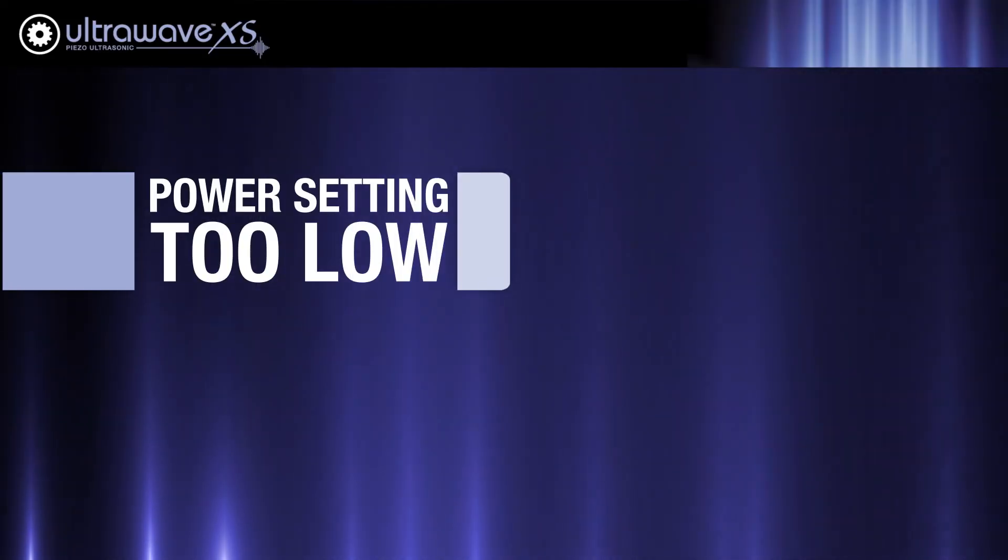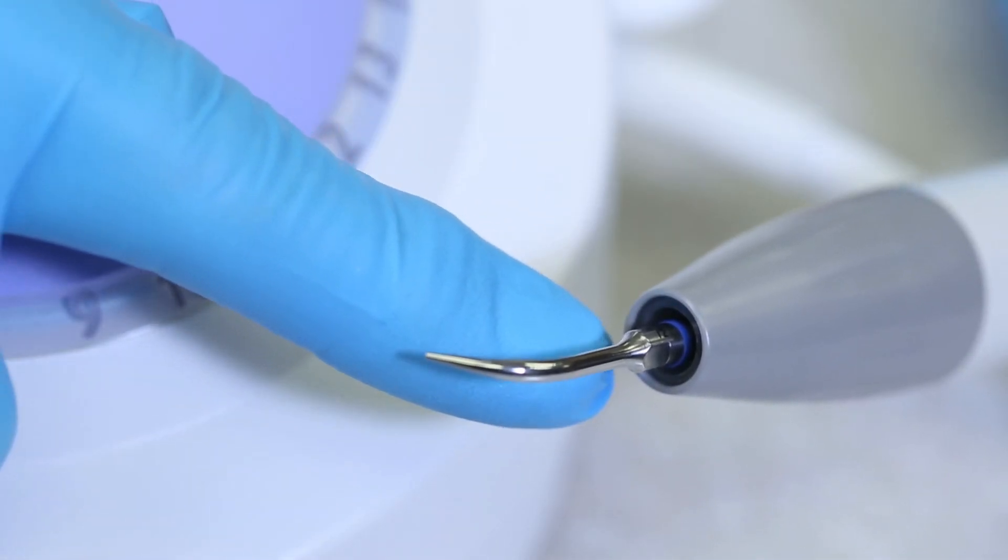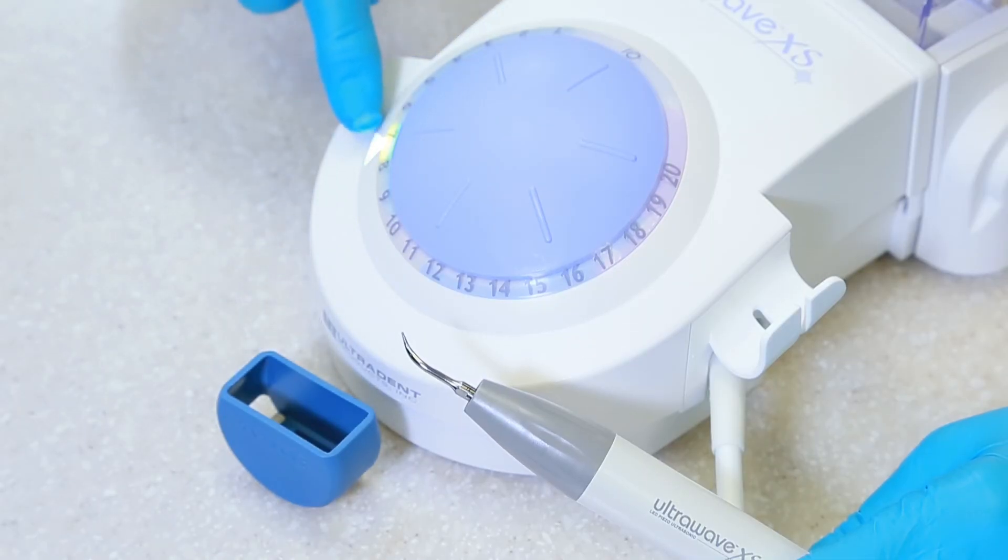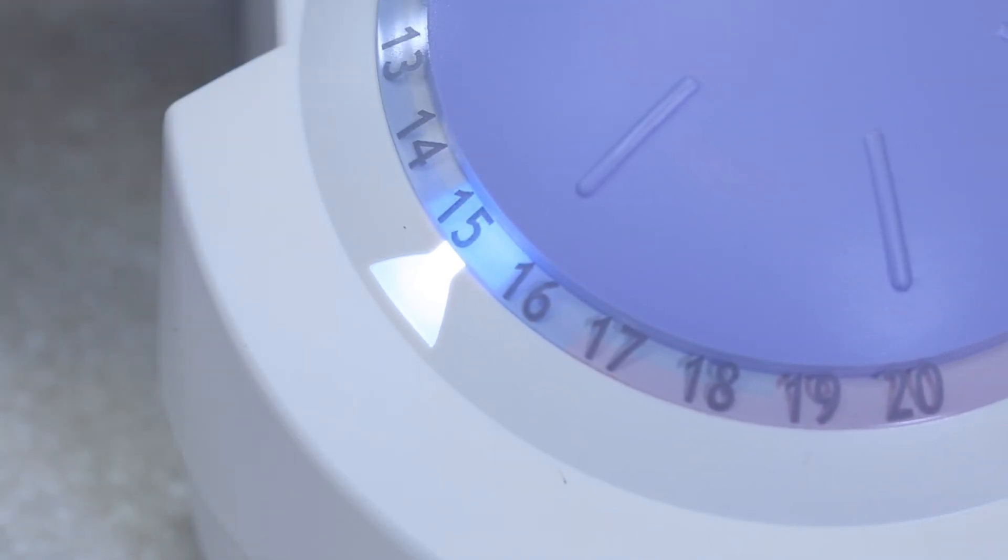The Ultrawave XS uses a color coding system to ensure that the proper power is being used with the proper tip. Make sure that the color of the tip and the colors shown on the dial match.